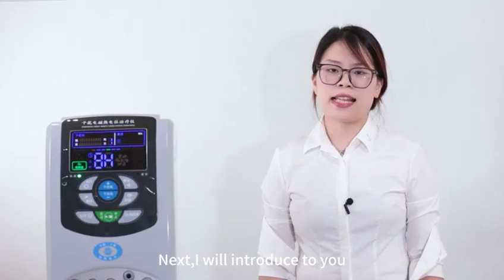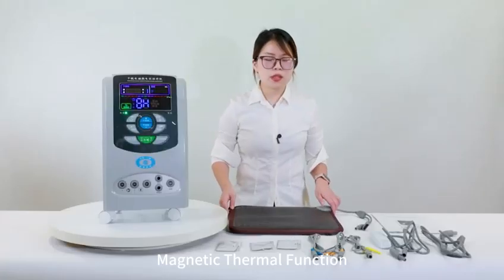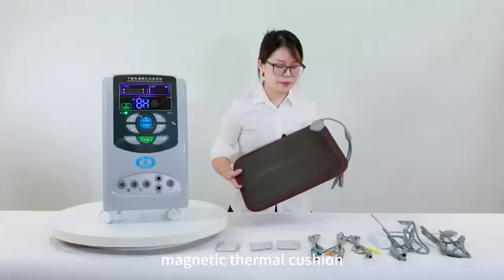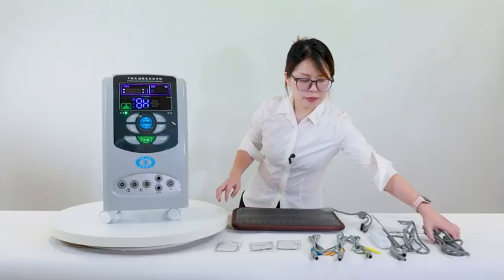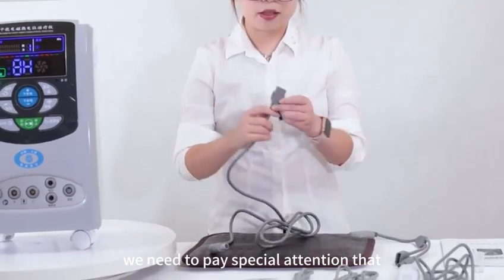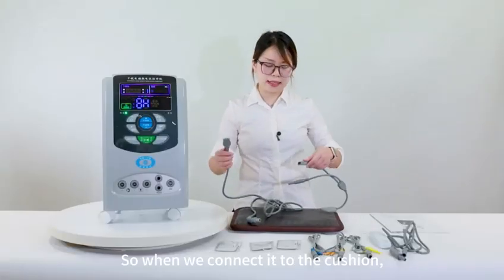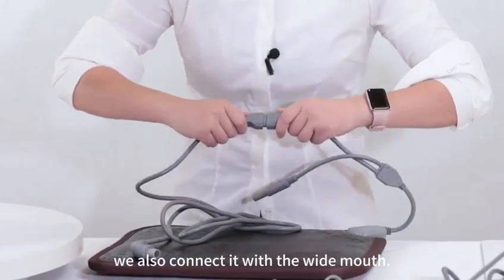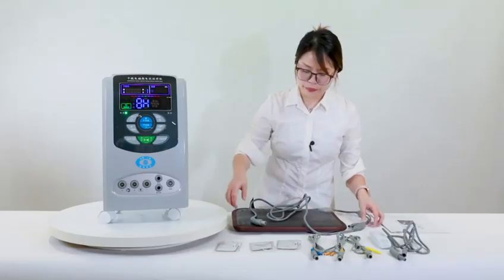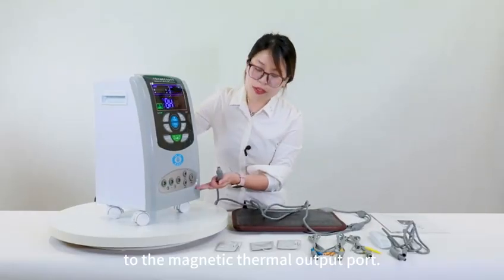Next, I will introduce to you the third function of this instrument, the magnetic thermal function. The accessories needed for the magnetic thermal function are the magnetic thermal cushion and the thermal connection wire. We need to pay special attention that the head of the thermal cable is wide, so when we connect it to the cushion, we also connect it with the wide mouth. Okay, the cushion is now connected successfully. Connect the other end of the cable to the magnetic thermal output port.